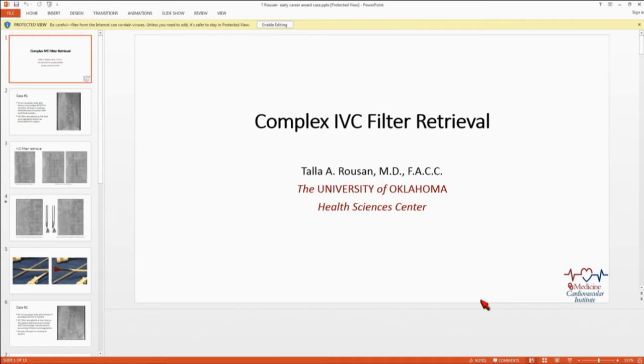I had a case actually that I've been following now for about a year and a half with CTs, and he did not want to have any more treatment. And we measured the hook that penetrated through the IVC to the vertebra, to the aorta, to the actual wall of the vein. You can see it very nicely on CT. And serial CTs have shown absolutely stable position, has not migrated beyond that point. And so we keep following him in a very, very conservative manner.